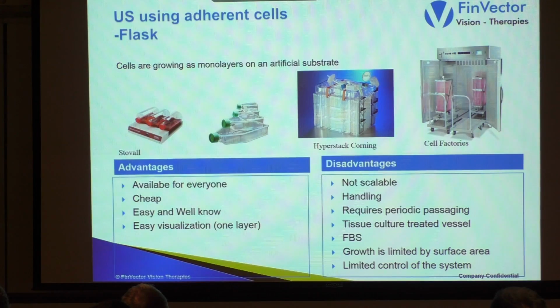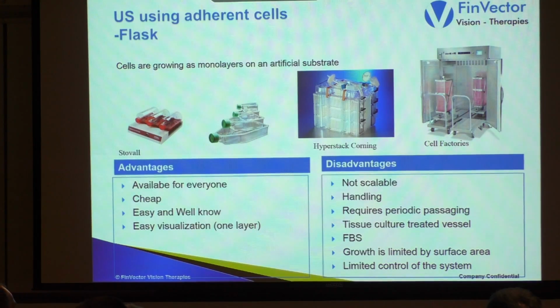When we are going a very traditional way, we do cell growth and production in flasks, different kinds of flasks. You can use roller bottles, different T flasks. Nowadays, I think one of the interesting approaches is to use HYPERStack from Corning, which gives you pretty good scalability if you still want to handle your cells only in an incubator. You don't have any bioreactor.